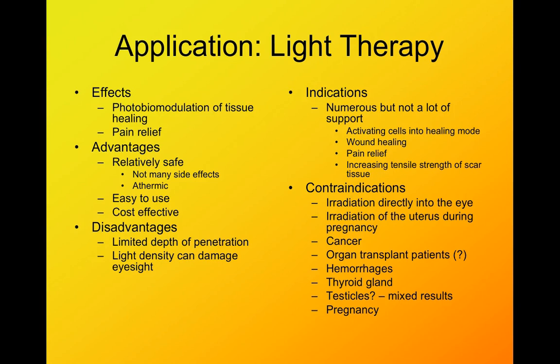Advantage, it's relatively safe. There's not many side effects. It's not producing heat, so it's athermic. So we don't have to worry about that stage. It's fairly easy to use, fairly cost effective. Disadvantages, it limits the depth of penetration. We have the risk and concern for eyesight. It's also not as effective for individuals with darker skin, so that's a limitation.